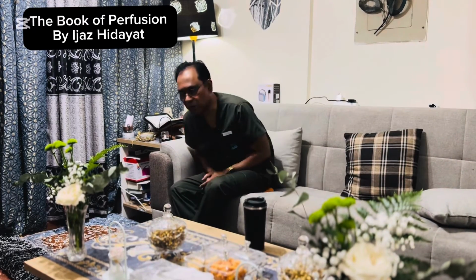So when your circuit is prior to prime, you retrogradely fill CO2 into the circuit, and once you remove all the air, you can prime and add the crystalloid, and you will find that your circuit is free from air and you get a better outcome of priming. So this is a different strategy you can apply to keep your circuit free from air.